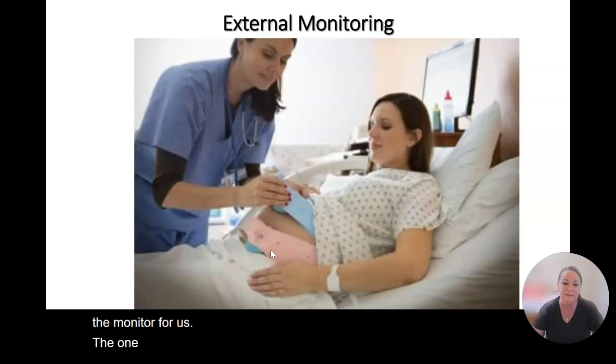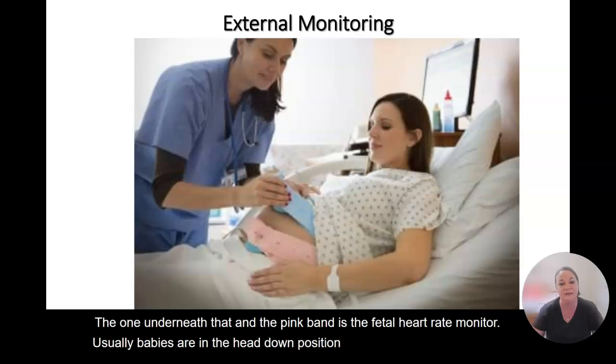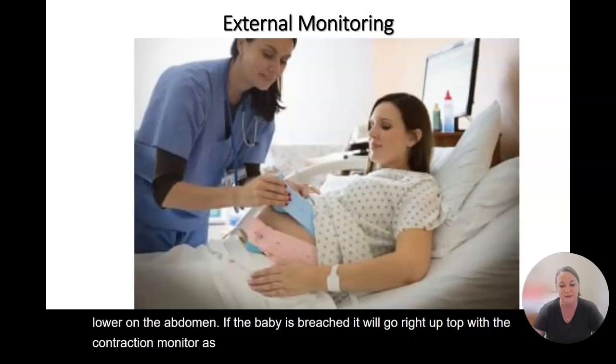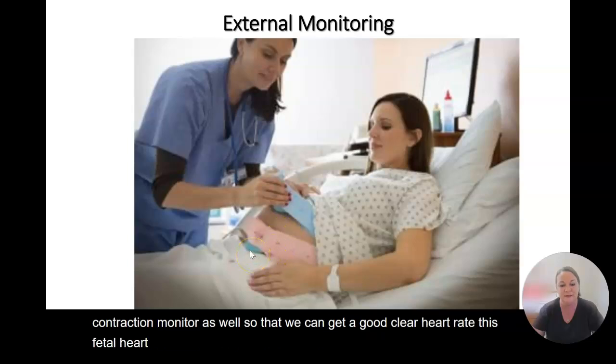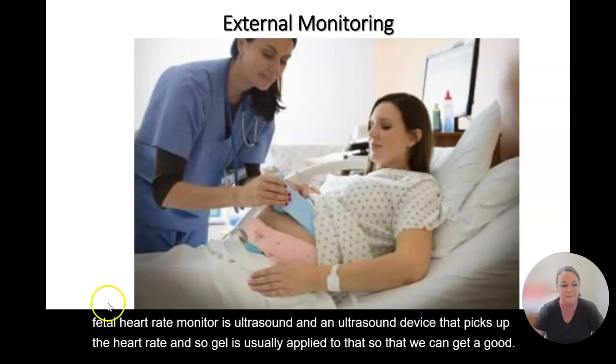One underneath that, and the pink band, is the fetal heart rate monitor. Usually babies are in the head down position, so this would be placed lower on the abdomen. If the baby is breech, it would go right up top with the contraction monitor as well, so that we can get a good, clear heart rate. This fetal heart rate monitor is an ultrasound device that picks up the heart rate, and so gel is usually applied to that so that we can get a good connection.